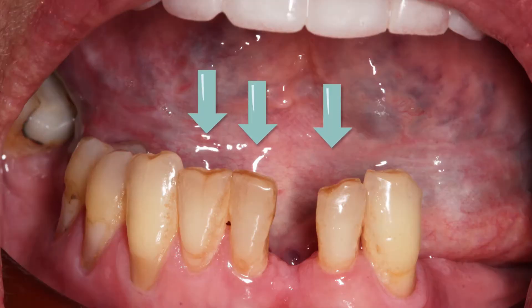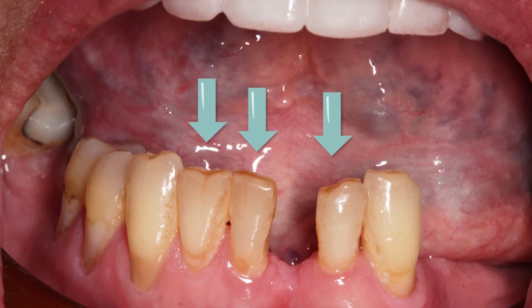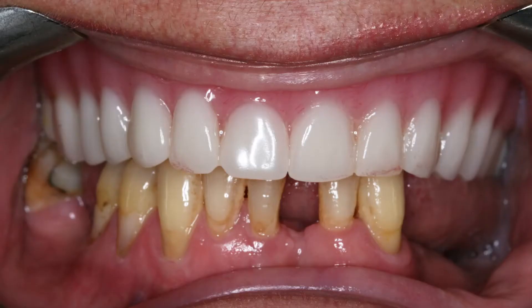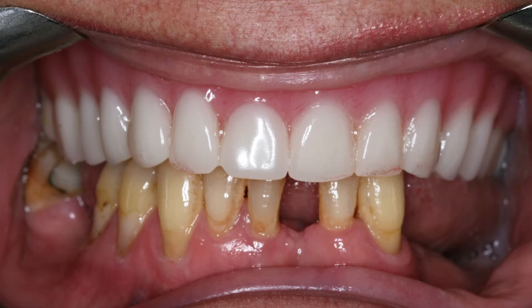First, we will stabilize the lower incisors with a fiberglass splint, and at the same time, using the same fiberglass, construct an infrastructure upon which a false tooth will be built out of composite material. She has a full upper denture which she will keep, and of course she is more or less satisfied with. This video will show all the steps of the procedure.